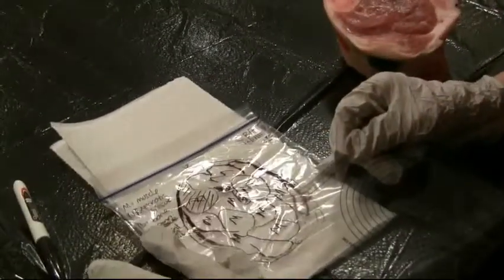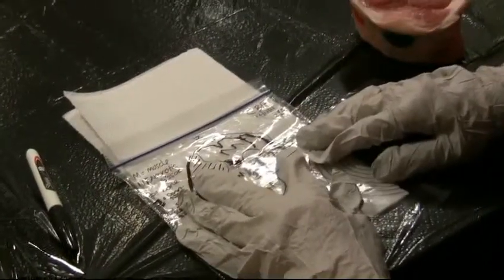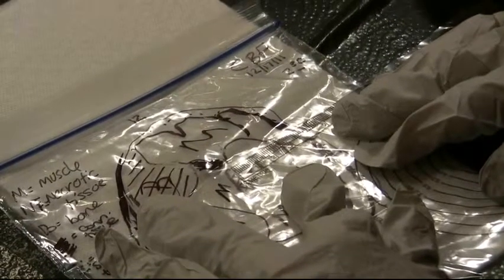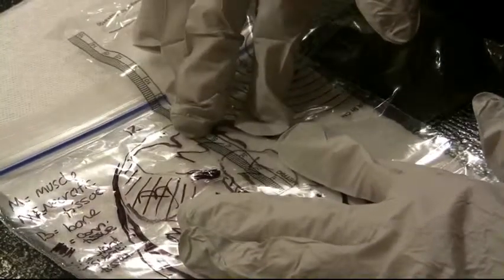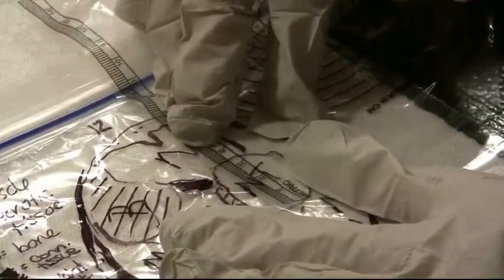So for surface area, I'm going for greatest length and greatest width. So the greatest width is 2.7 centimeters by 3.4 centimeters.